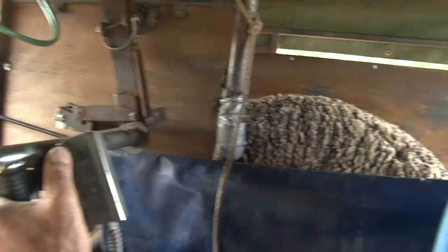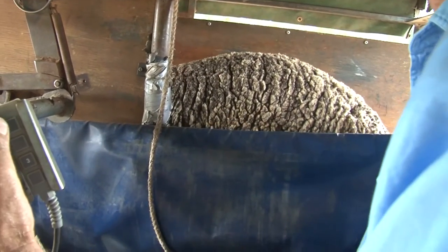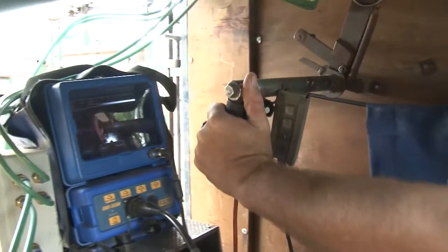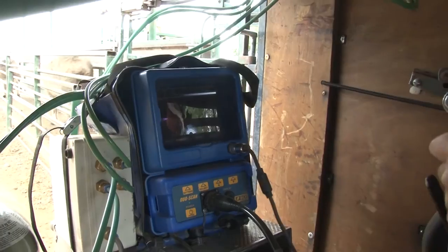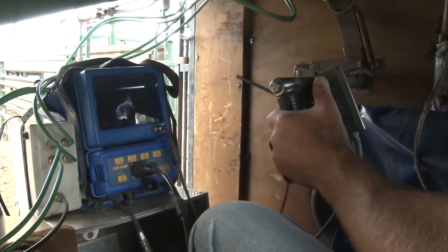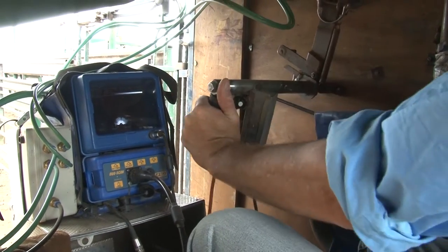We're drafting as we go. Once again, contact on the skin, scan through the uterus, run to the back. One — so put in the single. Same again, single, straight in the middle.